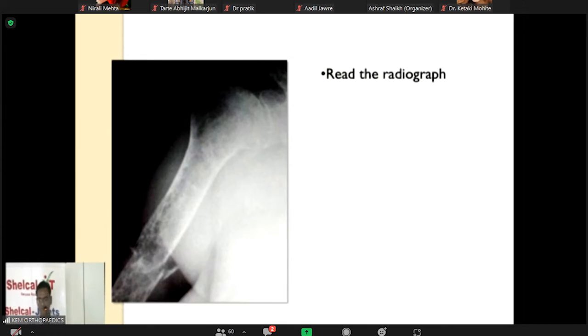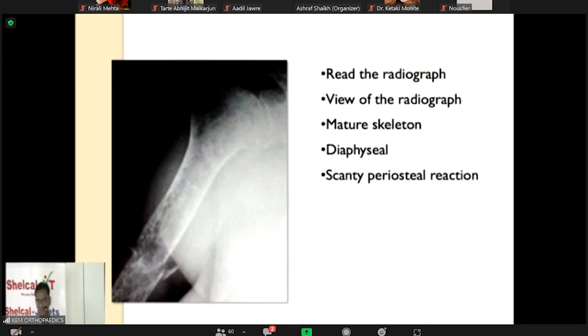There is an X-ray of right shoulder with a lytic lesion centrally located. One is near the GT, and another is near the mid shaft, with fracture of the medial border over the shaft. You can appreciate generalized osteopenia, the cortices are really thinned out all around. Correct.